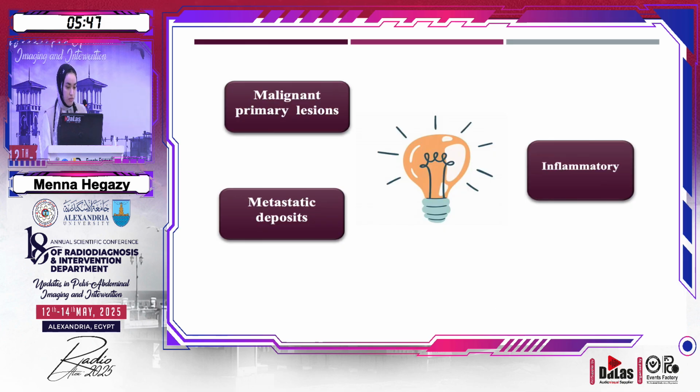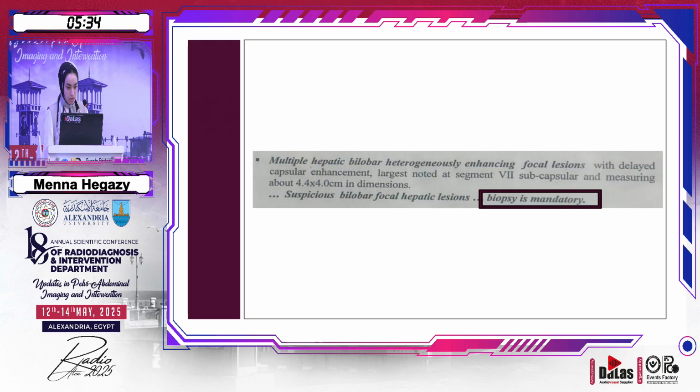Usually when we're presented with focal hepatic lesions of no specific pattern of enhancement and no specific past medical history, we think of them as being primary malignant lesion or metastatic deposit, or they can either be inflammatory. The radiologist at that time reported heterogeneously enhancing focal lesions and requested biopsy.